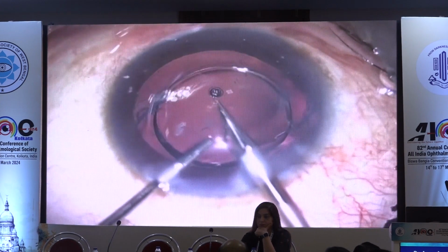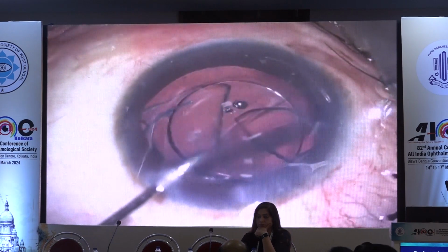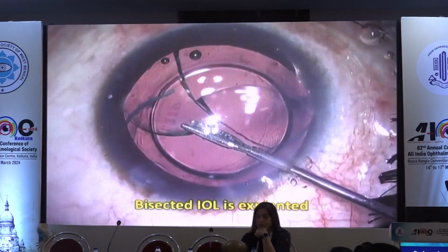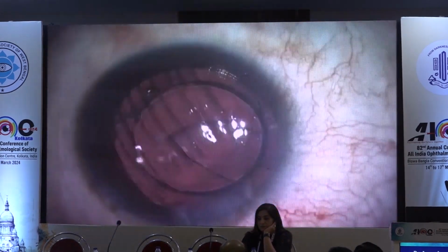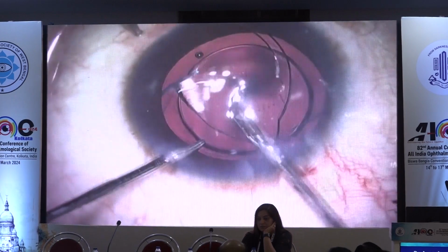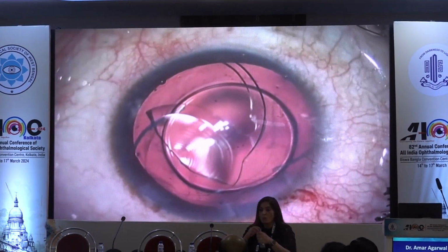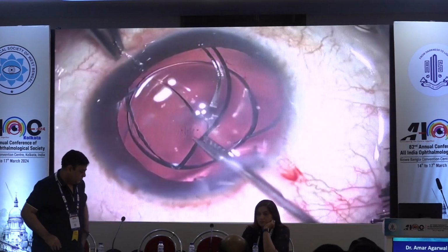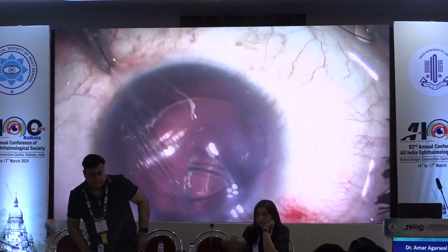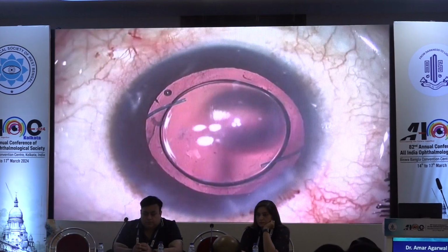Because my IOL is already there behind, I will not rupture the posterior capsule, and we published this in the JCRS previously. Anyway, coming back to this case, now what have I done? I have solved my issue of spherical. But please understand, I have an astigmatic problem. My second problem is, remember, this patient had a multifocal IOL. That means he is very clear, he needs to see distance and near without glasses post-operatively.